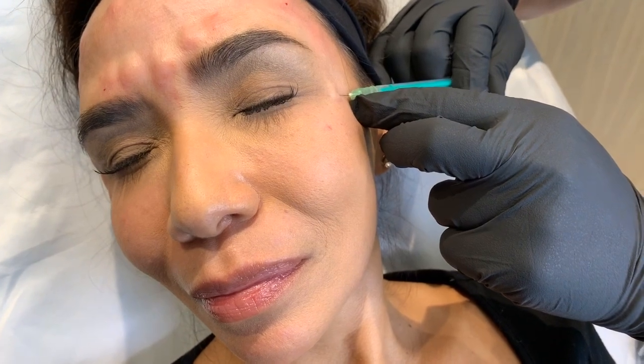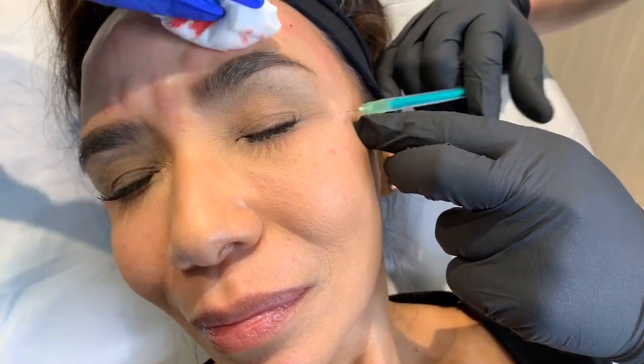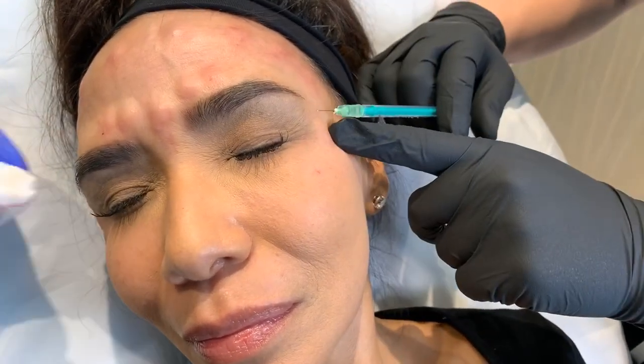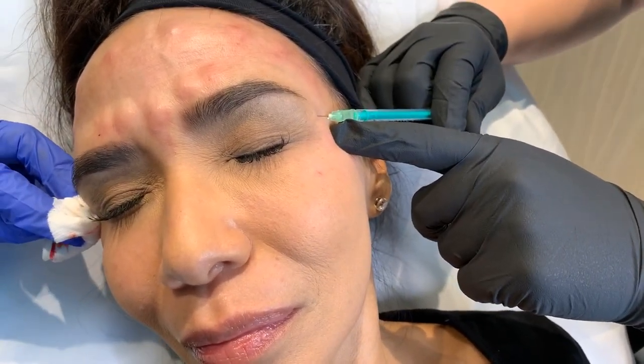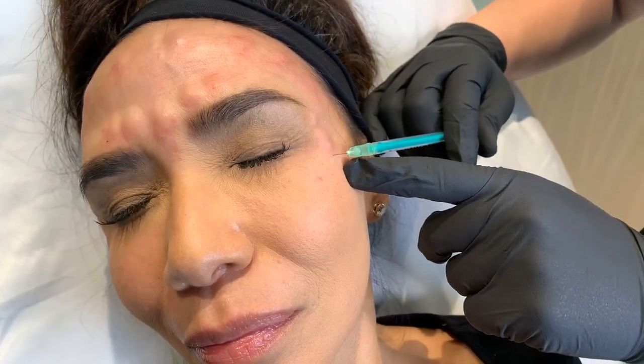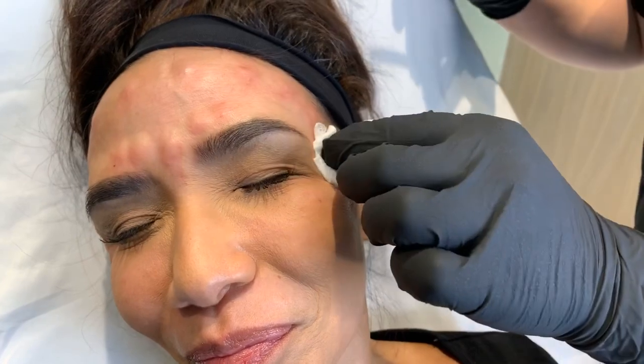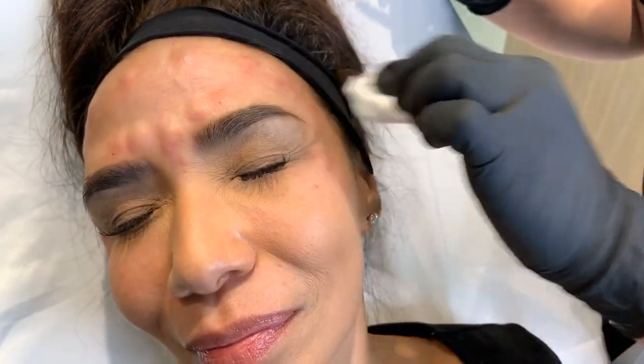In the old days, we used to do one bleb. I called it the matzo ball technique. You smash it down and it goes all the way around. You could still do that. That's because I did my training in New York. So that's why we called it matzo ball. And now, just do a little bleb. We customize it. So that's perfect.